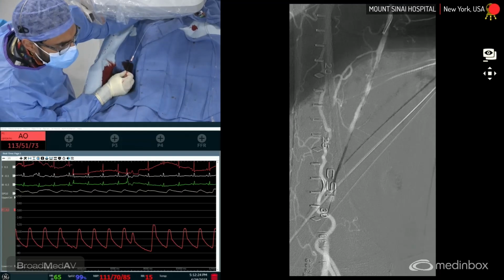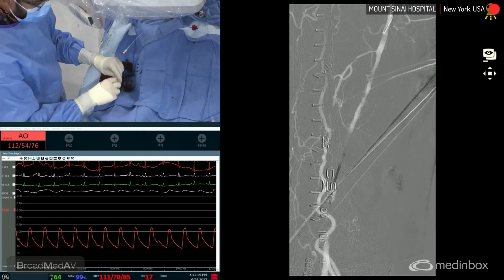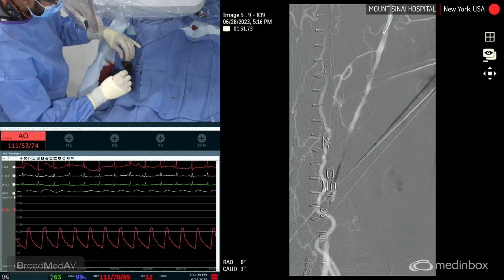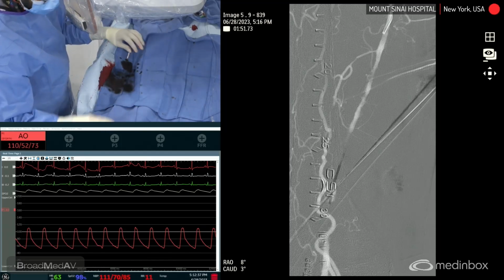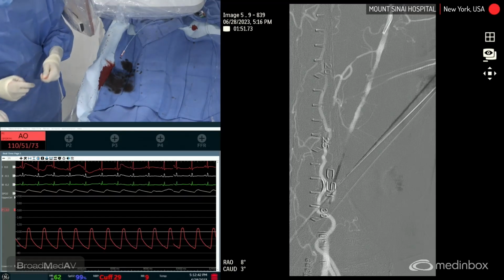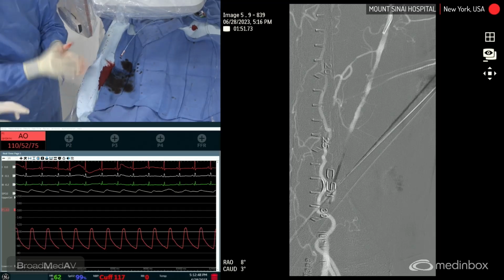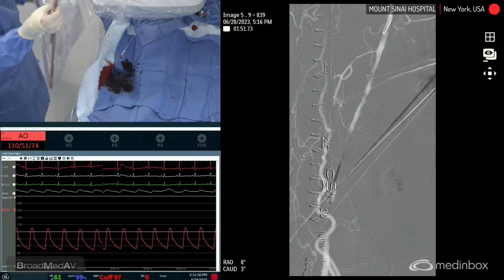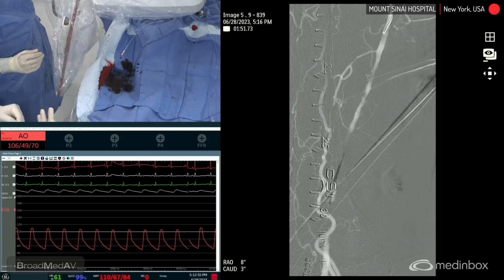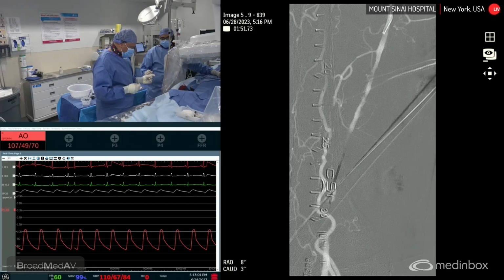Obviously I asked for a 300 wire because all of our endovascular cases require a wire with length in order to exchange for the next catheters and devices that we're going to have to use. The tip load was 14 grams, right, Ibrahim? 12. Okay, 12-gram tip load here. Obviously we have much higher tip load wires that we need, but this seems to do the job in most cases. At this stage, our plan is to try to cross this, do an intravascular ultrasound, decide our therapy, and take it from there.